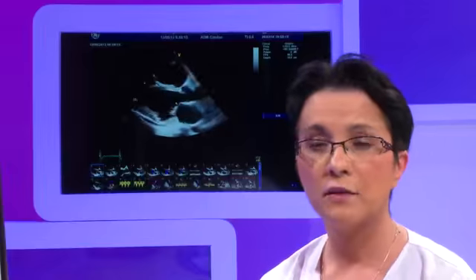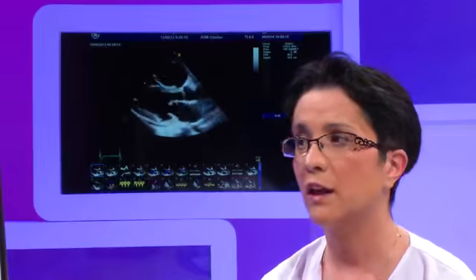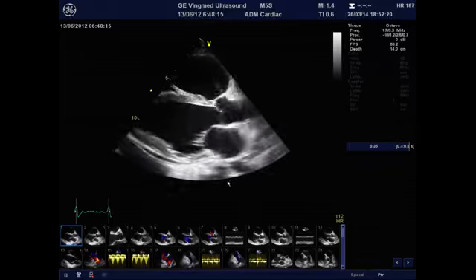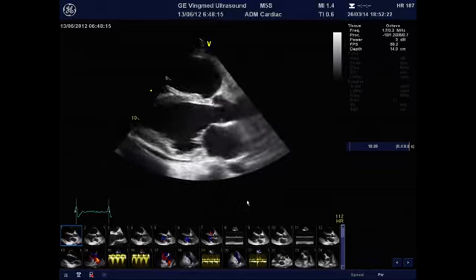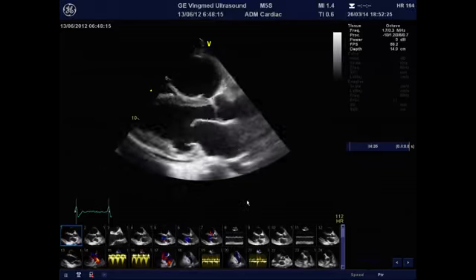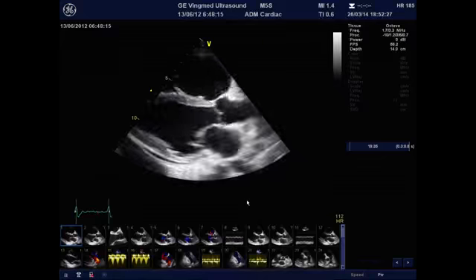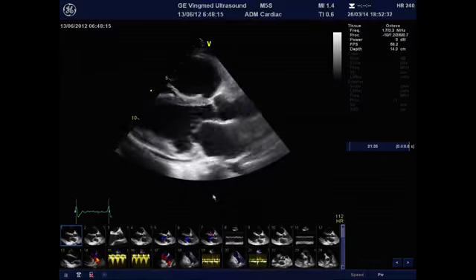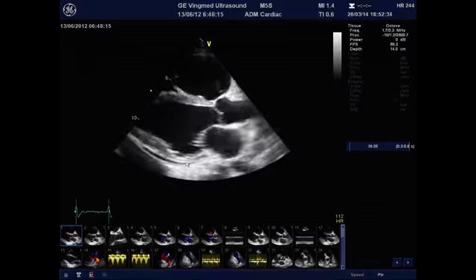And this is a case of a young 39-year-old woman with systemic sclerosis known for several years who came to our department for dyspnea at minimal exertion. When beginning the echocardiography, we can observe from the very beginning that the ventricle, which is not dilated, having a diastolic diameter of 50 millimeters, has an obvious left ventricular systolic dysfunction, both global, and we will go to this also in the following measurements, and also regional.